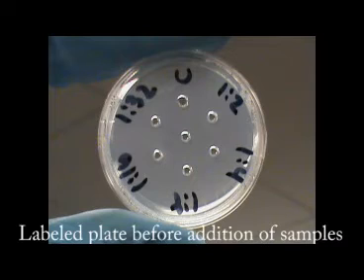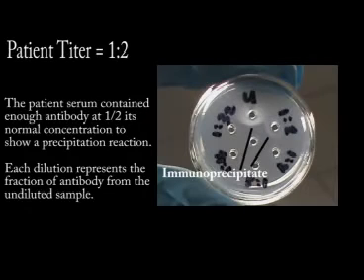Each of the patient samples and their dilutions were loaded into the remaining six wells in numerical order: undiluted, 1:2, 1:4, 1:8, 1:16, and 1:32. As the patient samples and the antigen diffuse through the media, they will meet and precipitation reactions will occur.